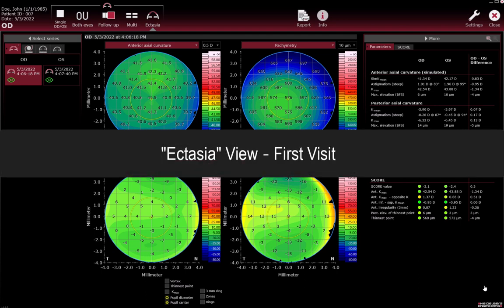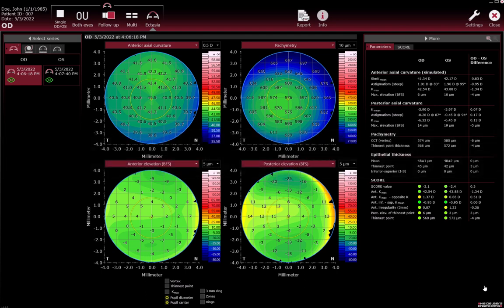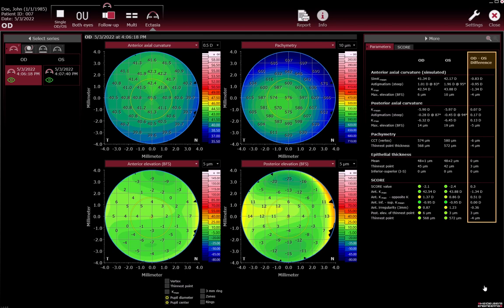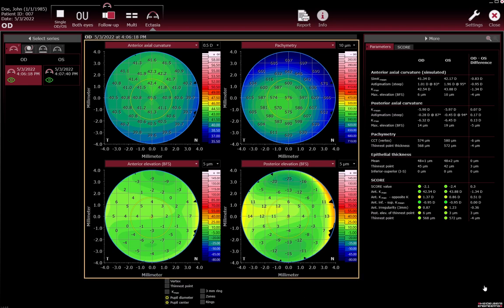Ectasia view — first visit. If examinations of the left and right eye were performed within 24 hours, the newest examination of the other eye is automatically selected and marked by a red frame. The differences in measurements between the examinations are displayed on the Parameters tab. The colour maps section and the Score tab display the measurements of the examination that is highlighted in red.